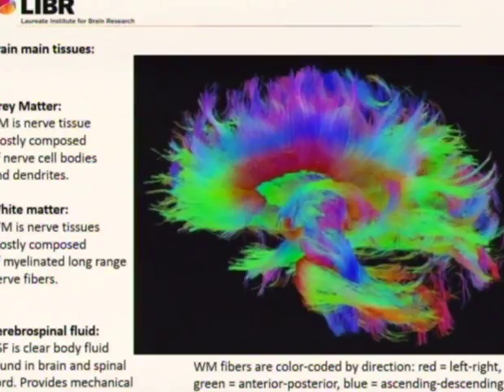It's a 2D image, but the white matter fibers are not aligned only on those planes. They are going outside, they're going top and down, they're going left and right. This image essentially is like a projection, and the directions of the fibers in the white matter are encoded as colors. So on the previous image, the white matter looks boring. This image looks gorgeous and shows you how complex even white matter actually is.